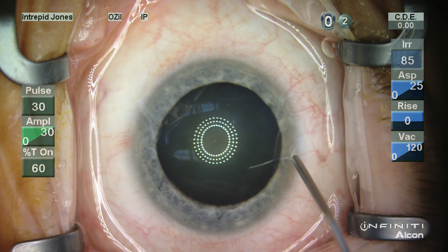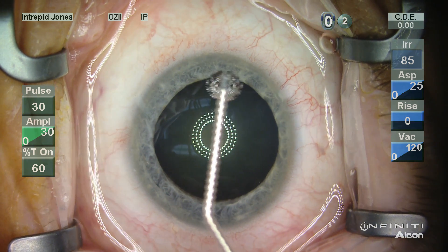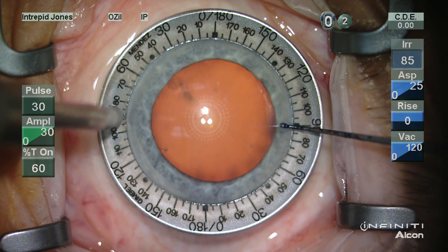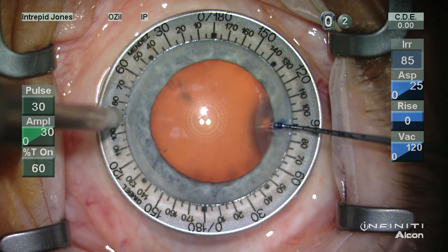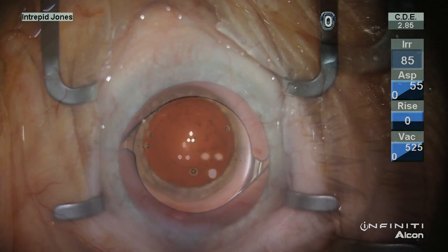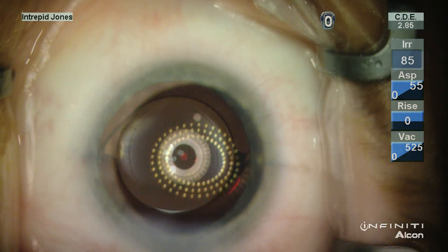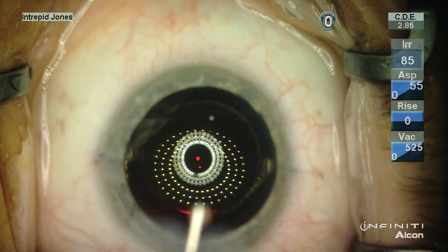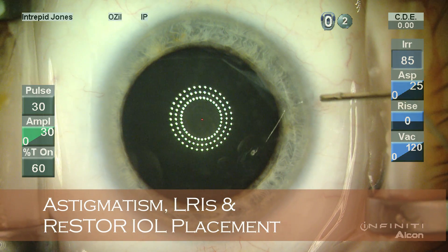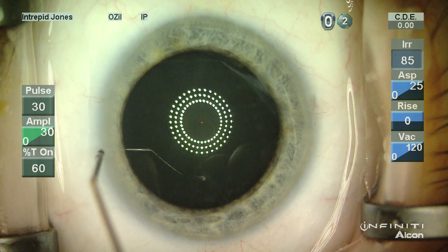Here is a fairly typical use of the keratoscope. You'll note here that the reflex is oval in nature and by bisecting it using a cannula, you can more readily see the astigmatism. Qualitatively, this aids in location of the astigmatic correction, and most importantly at the conclusion of surgery, one can verify that you have a correct orientation of the lens by comparing the astigmatic correction of the lens versus the corneal reflection.